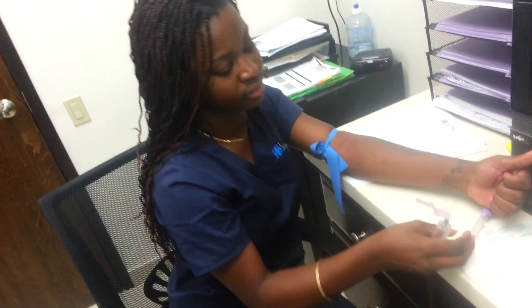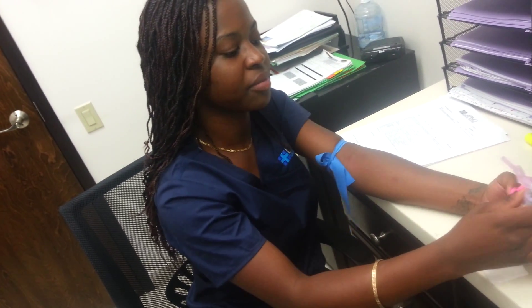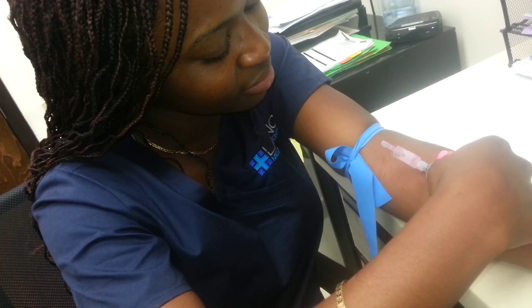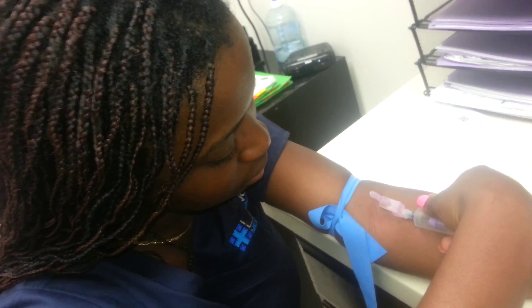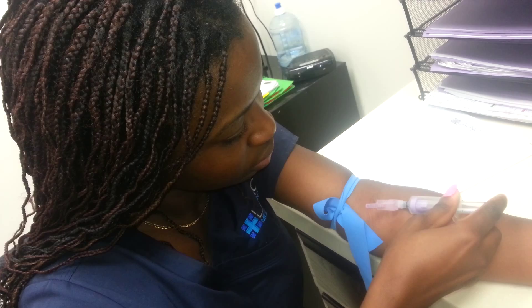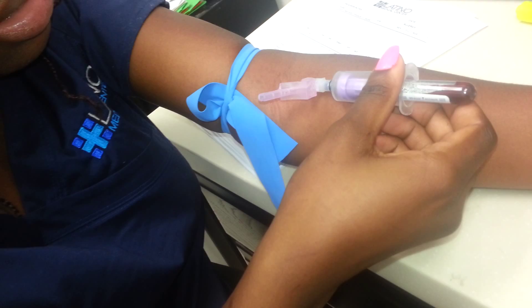Here we go. Fear is a sin. Here's what we've been waiting for, right? Ready? Two. Ready? Go. I got to push the needle into my skin. Bingo! You see my blood? Look at my blood. Yes! Bingo! Bingo!